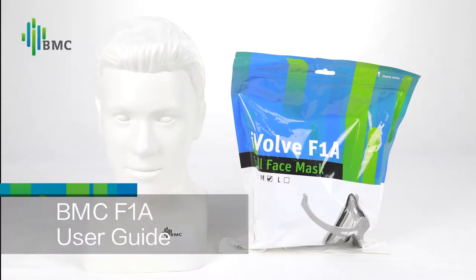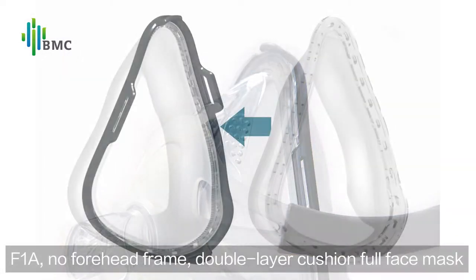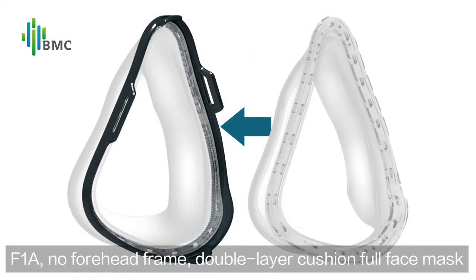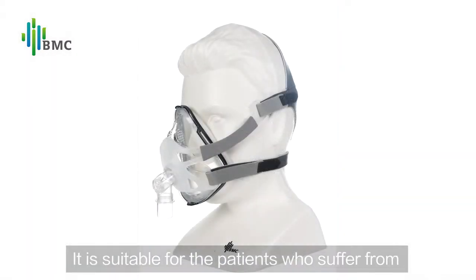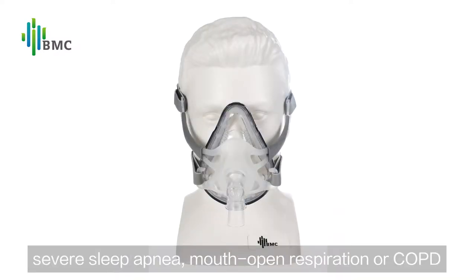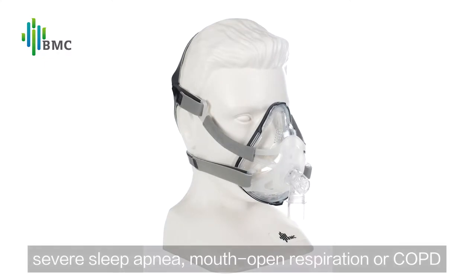BMC F1A User Guide. The F1A No Forehead Frame Double Layer Cushion Full Face Mask provides better vision and seal. It is suitable for patients who suffer from severe sleep apnea, mouth open respiration, or COPD.